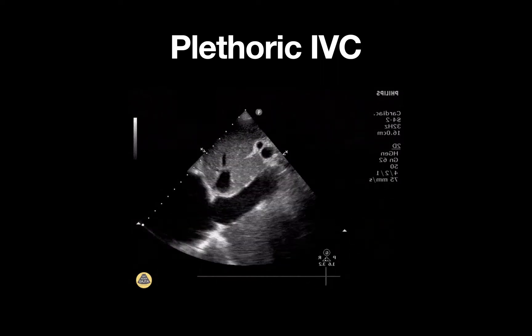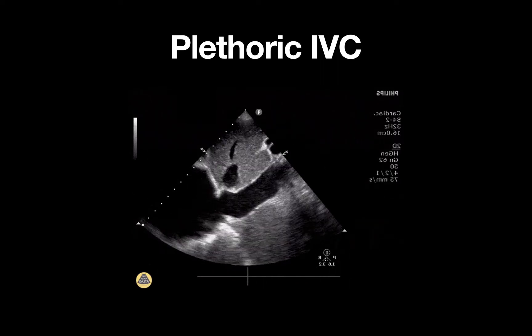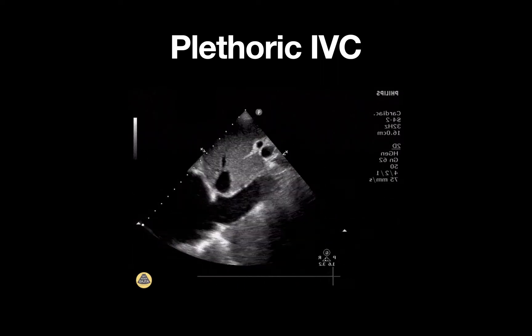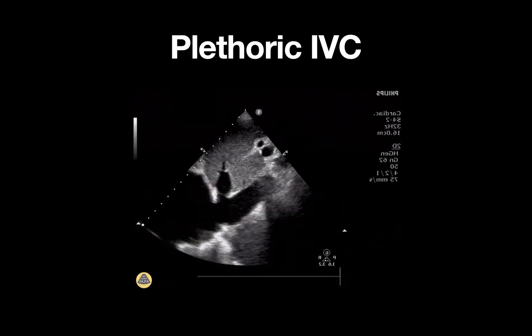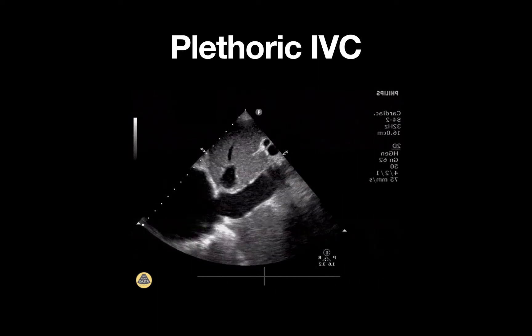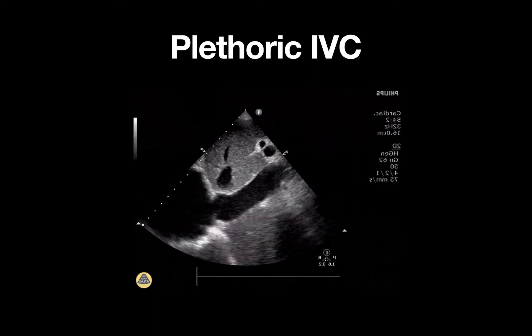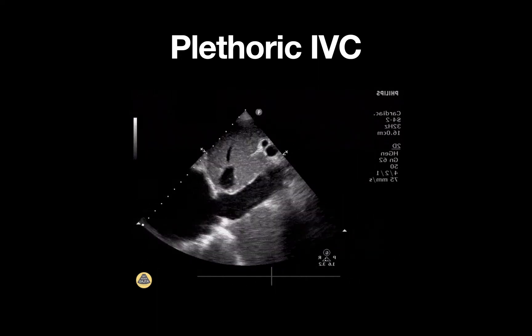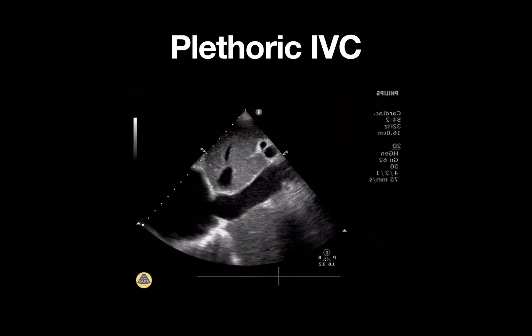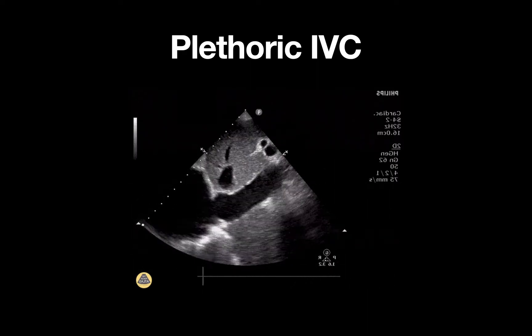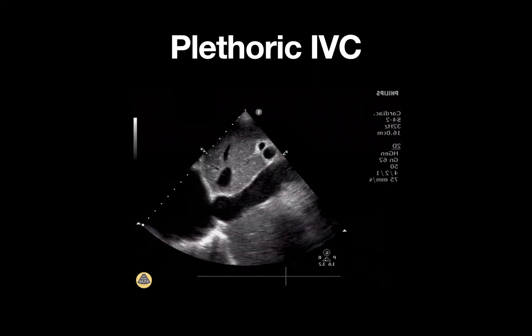This is an ultrasound clip demonstrating a plethoric IVC. A phased array probe is used and placed in the subcostal region just to the right of the patient's midline, with the probe marker pointed towards the patient's feet.